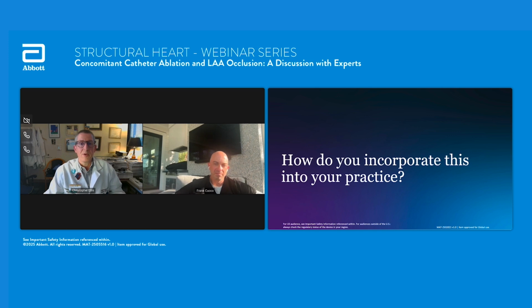This is because you're not going to ablate someone that's totally contraindicated to anticoagulation typically. So they're usually a patient that could at least go back on blood thinner for a while, and then you could close them later if necessary. So in my practice, incorporating this, it's a no-brainer for the people that have a strong indication for both parts of it. And I think my threshold to offer pulse field ablation is a lot lower than it ever was with RF in patients that are primarily coming to get their appendage closed.